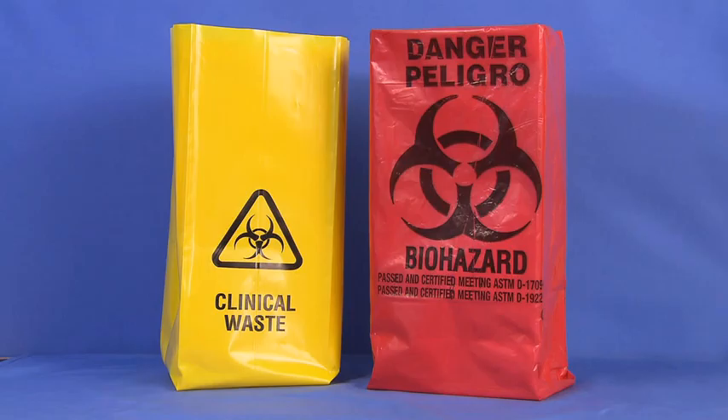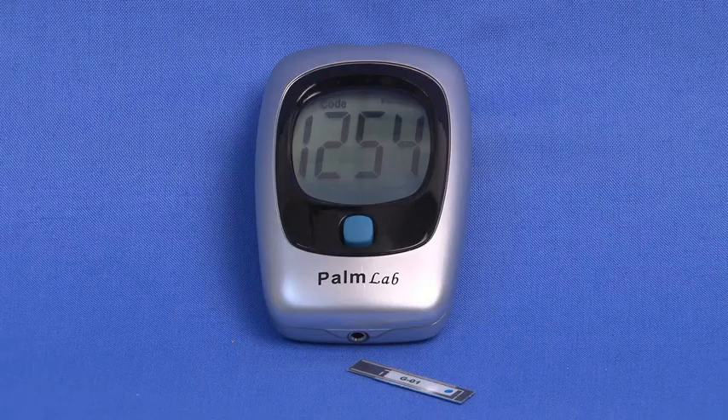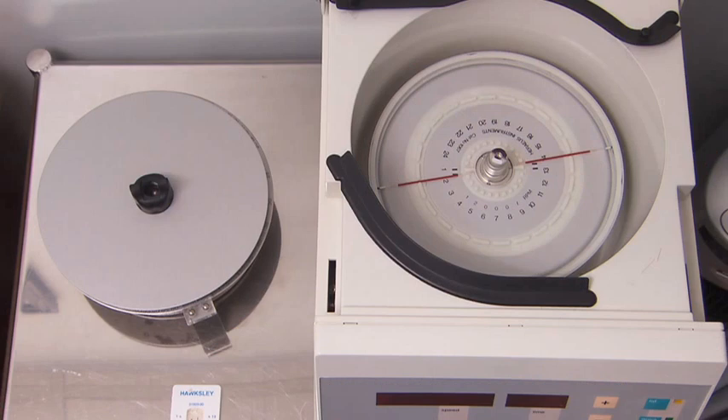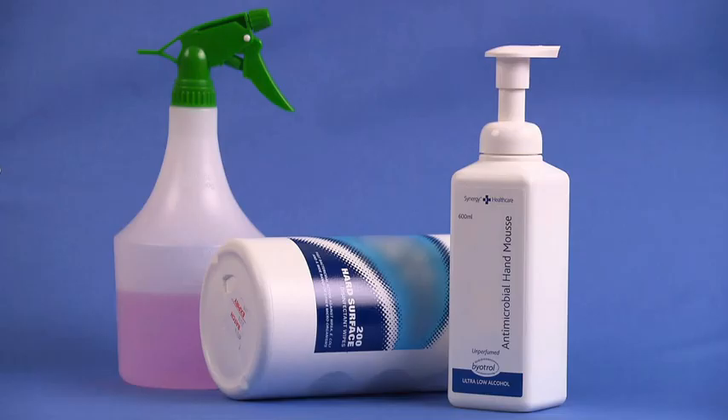While biohazard bags come in various colors, they can be identified by the universal biohazard symbol. Please check your institution and state regulations to confirm which bag is used. Additional equipment includes a glucose monitor and test strips, a cholesterol testing device and test strips, a micro-hematocrit centrifuge, cleaning agents including antimicrobial soap, and the patient's medical record.